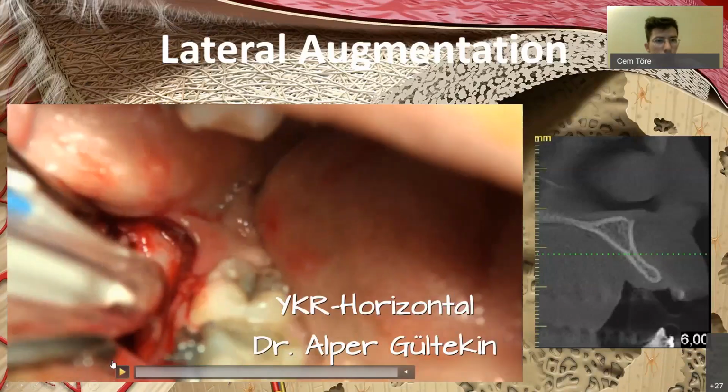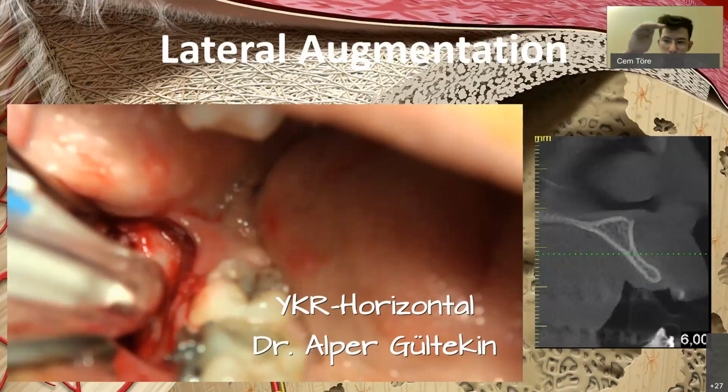I will be talking over this video. What we are using here is a bone scraper called a safe scraper. It's a single use device to collect bone from an area. The donor site which we have chosen here is the lower posterior mandible. This is a separate incision in that area, just so we can collect some shavings of bone from that area to mix with xenografts later.